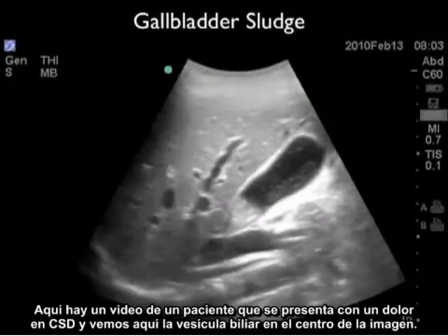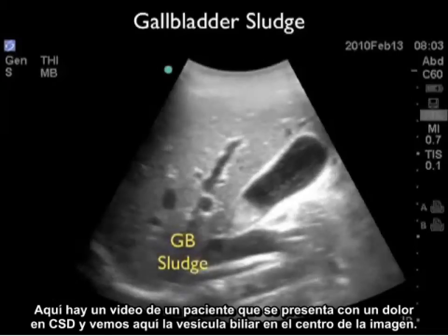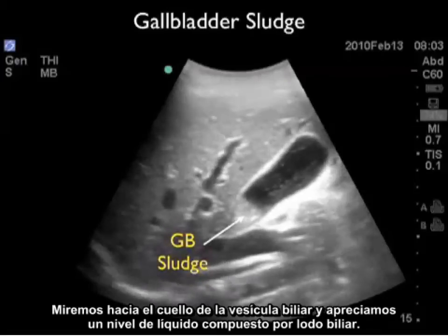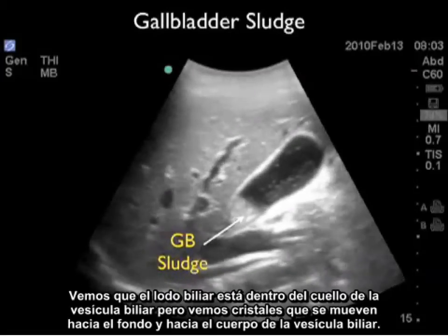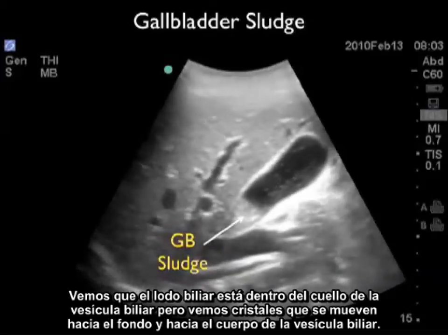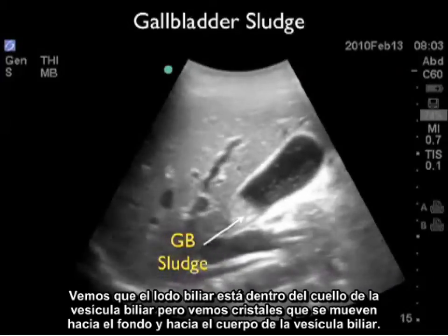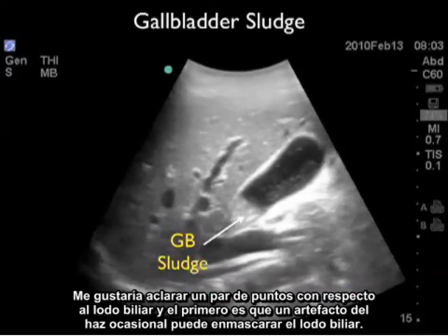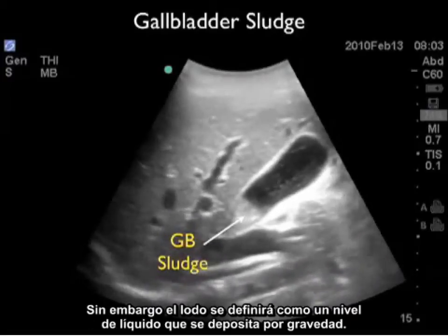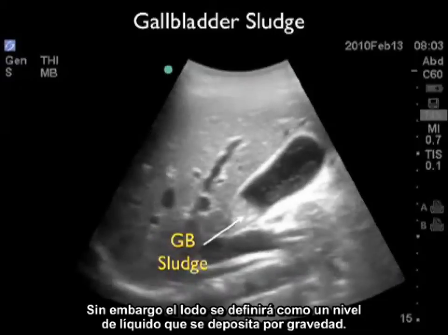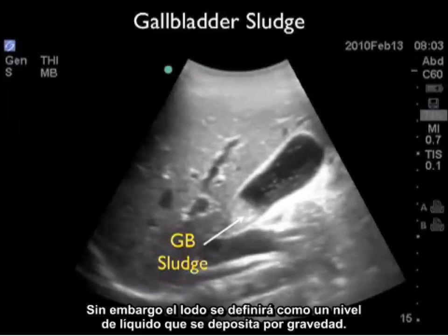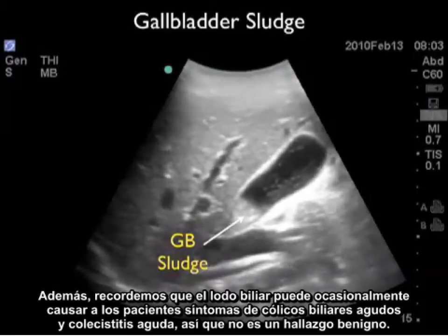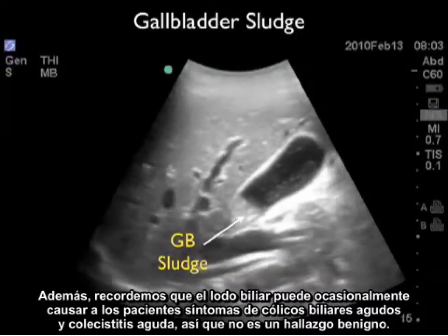Here's a video clip from a patient who presented with right upper quadrant pain. We see the gallbladder in the middle of the image. Looking towards the neck of the gallbladder, we appreciate a fluid level made up of gallbladder sludge. The sludge is tucked in towards the neck, but we see crystals moving up towards the fundus and body. Notably, beam artifact can masquerade as gallbladder sludge; however, sludge is defined as having a fluid level that layers out with gravity. Also remember that gallbladder sludge can occasionally cause symptoms of acute biliary colic and acute cholecystitis, so it's not a benign finding.